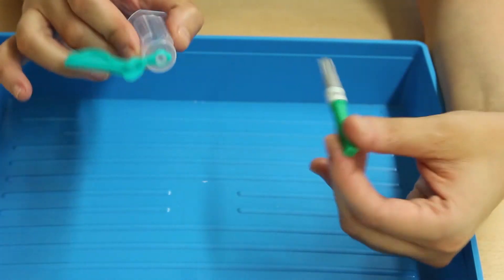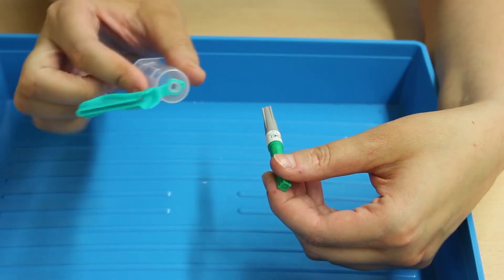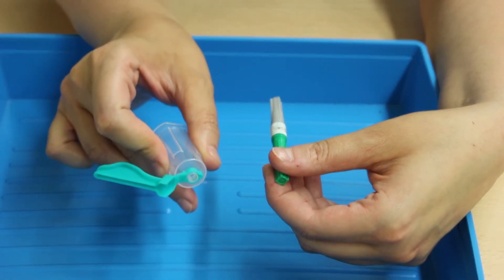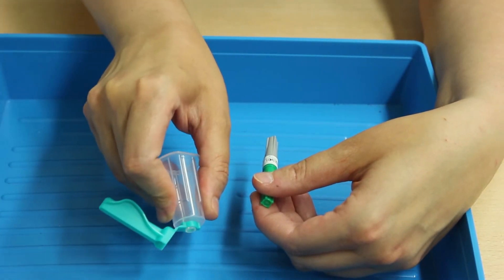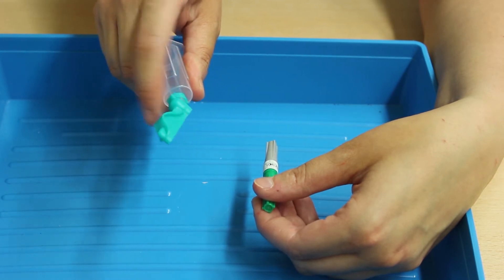Let me show you how to assemble the equipment. This is a vacuette holder — hold it in your dominant hand because you'll insert the needle and need to activate the needle safety guard on withdrawal. This is the needle; remove the gray cap and a black dot becomes visible. That black dot must face you, indicating the angle of the bevel.